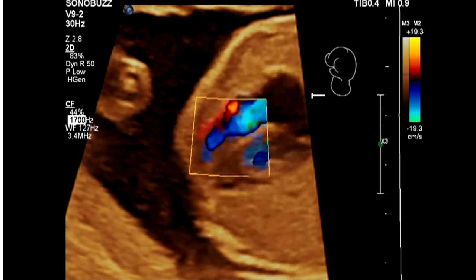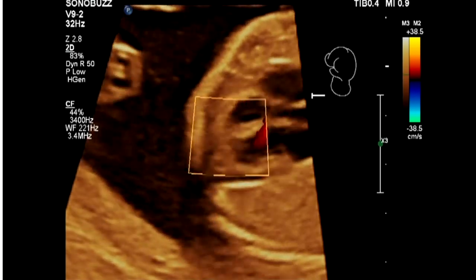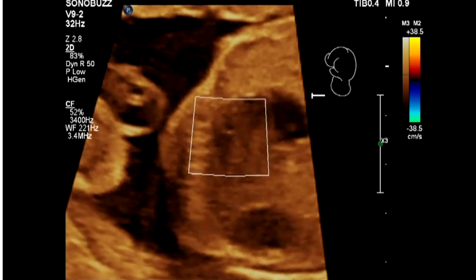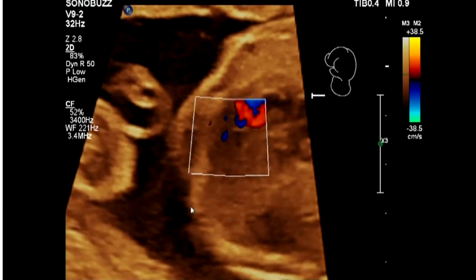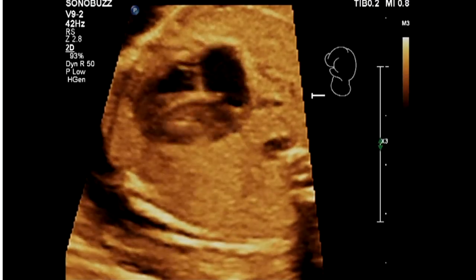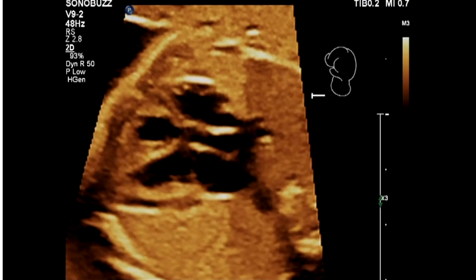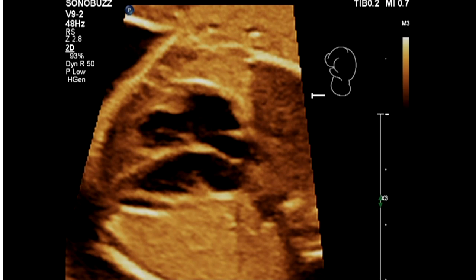You can put color on to look for VSD. If you lower the scale too much it bleeds — it's too much, so you have to do it just right, but not so low that you miss something. Same thing for the gain: if you put the gain too high it bleeds in, so you have to be careful. The apex — right now the angle is not very good and I might be missing something there. Going back to two hands — you can see the lower part of the atrial septum. Now let's do a pulmonary vein. You want to optimize the 2D picture first so that when you put color on you know where you'll see it.